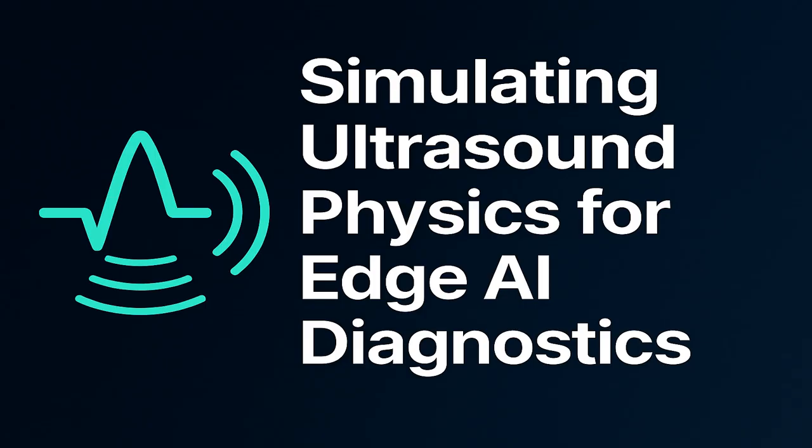So once we have that linear amplitude envelope, we are immediately confronted with the massive dynamic range problem. This is the third part of the processing step, log compression. As we mentioned, the difference between the strongest echoes right near the probe and the weakest echoes deep in the tissue can span an amplitude ratio of 1,000,000 to 1 or even more. So if you just displayed that linearly, the deep tissue would look pitch black and the near field would be blinding white. You wouldn't be able to see any discernible detail. It's like trying to take a single photograph that perfectly exposes both the inside of a dark cave and the bright midday sun outside. You can't do it.